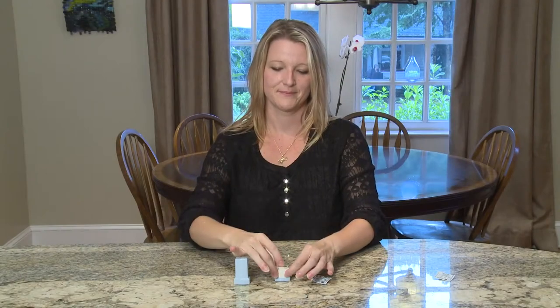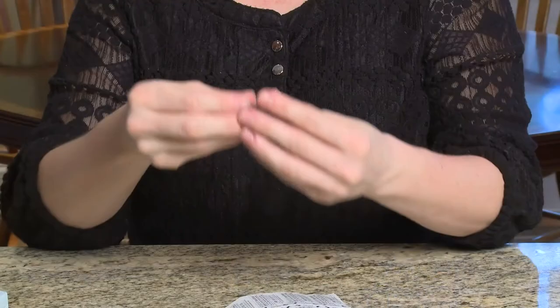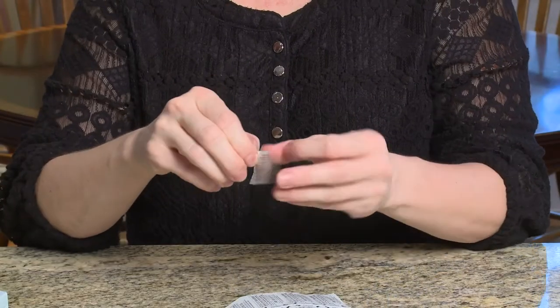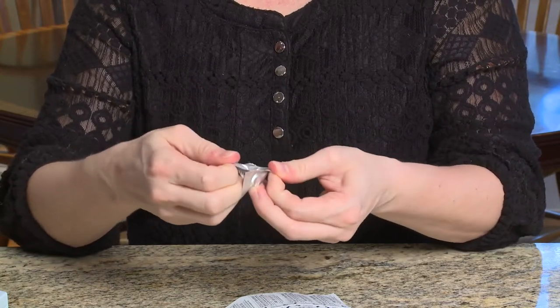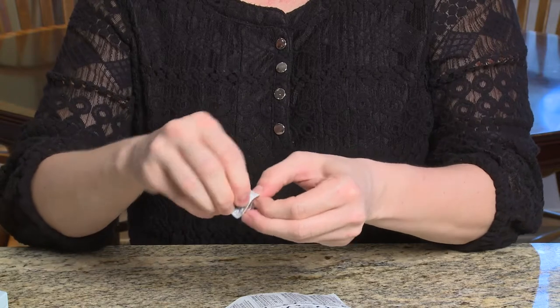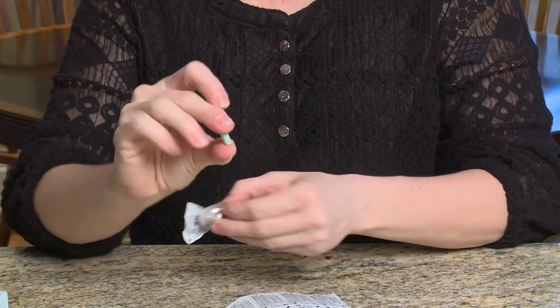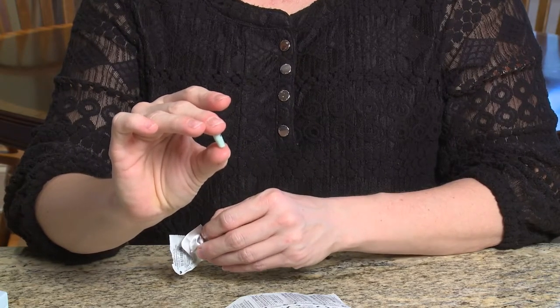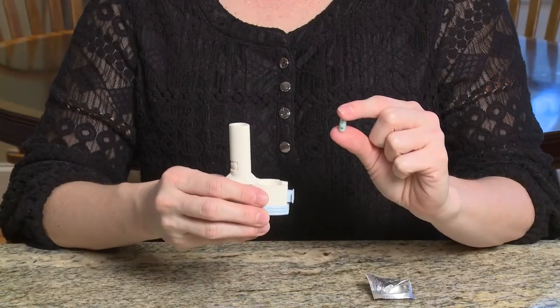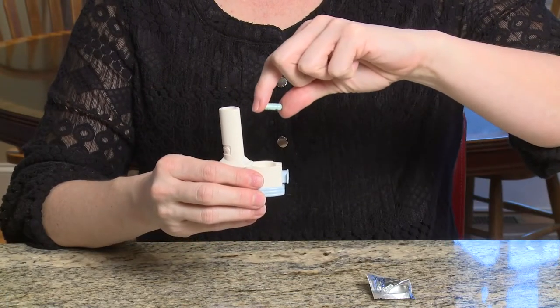Put your neohaler on a flat table or counter while you open your medicine capsule blister pack. Open your medicine blister pack by peeling the foil from one capsule only. Take out one capsule from the blister pack. Do not open the other capsules because they react to light and water. Never swallow these capsules — they should only be used with your neohaler. Once the mouthpiece has been opened, drop the capsule into the chamber.